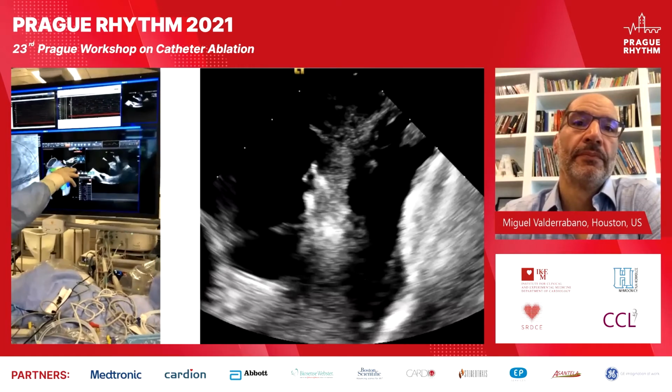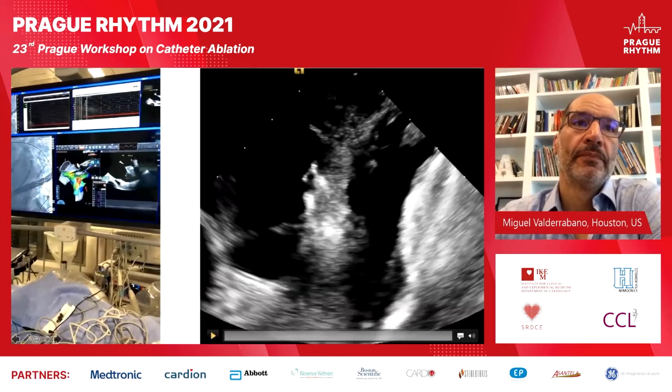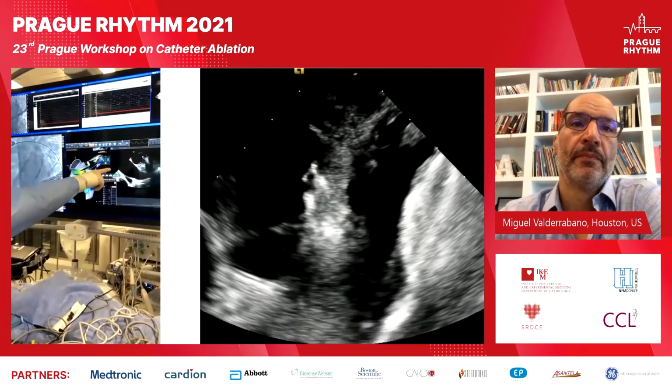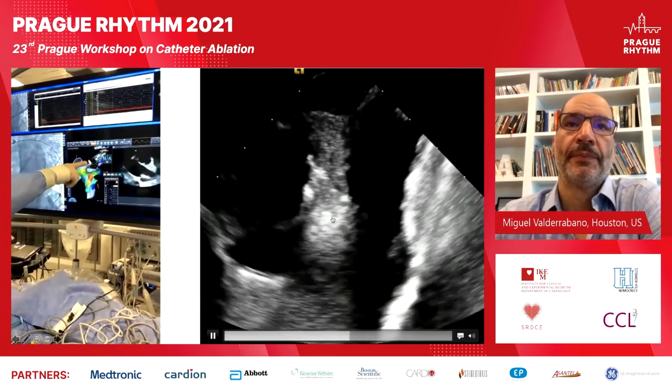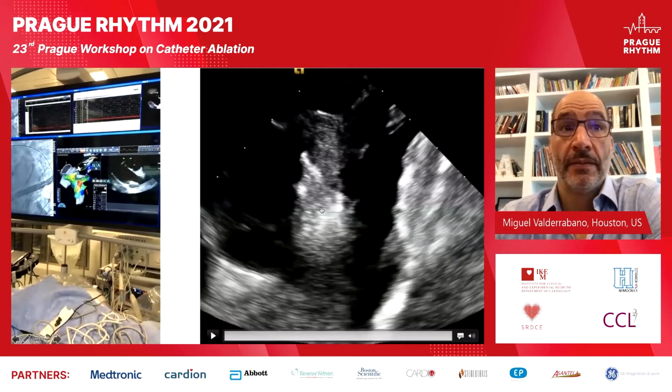We thought there was some shunting between the two balloons in undesired vein branches. So we have advanced the proximal balloon closer to the distal. You can see already some echogenicity in the area we ablated. There are bright areas there. We are in RAO. Let's see.